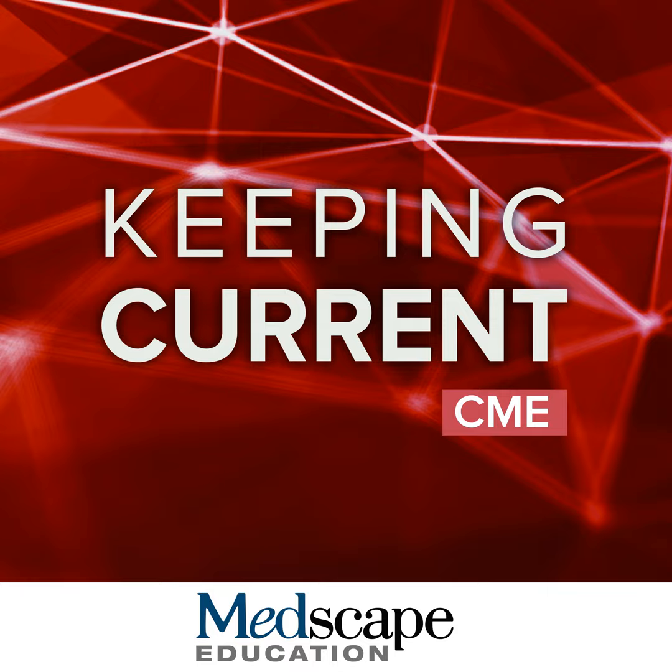You can see that the tau PET may also be helpful in certain situations. In this case, it was determined that the tau PET may additionally be helpful if someone is younger than age 65, or if they have atypical features.